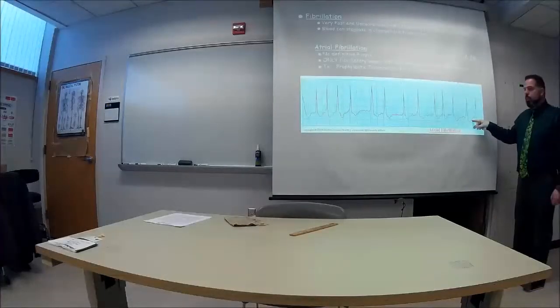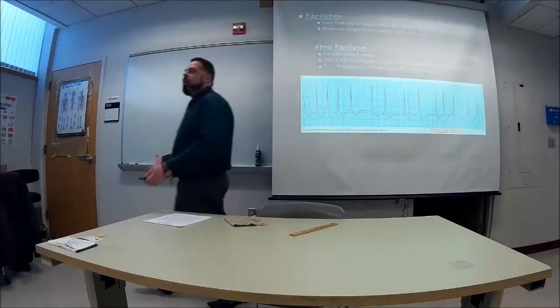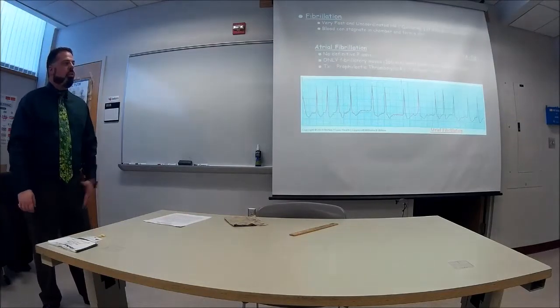Does that make sense? Okay? So it's going so fast that we can't even see a definitive P wave. All right? So that's what's happening with that. All right? So that's atrial fibrillation.